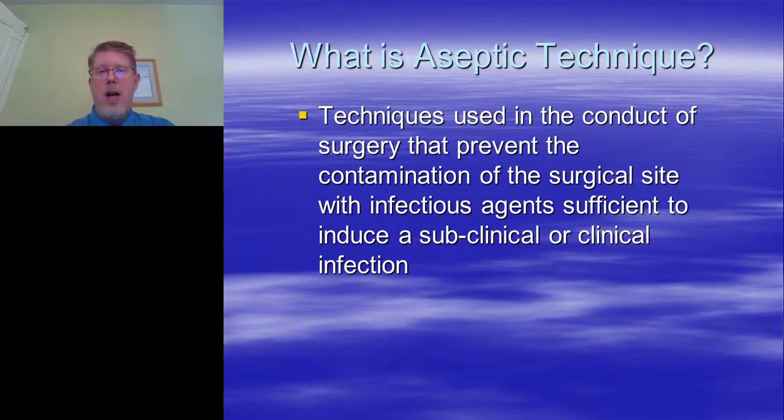So to focus a little bit more like a laser on surgery, aseptic technique is critical, absolutely critical. We're minimizing contamination of our surgical site. We don't want to create subclinical or clinical infections. Subclinical and clinical infections will change your results.